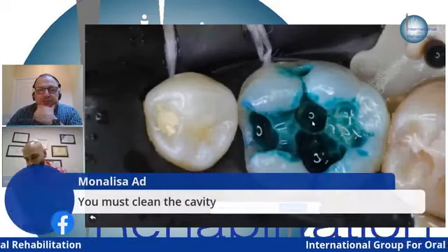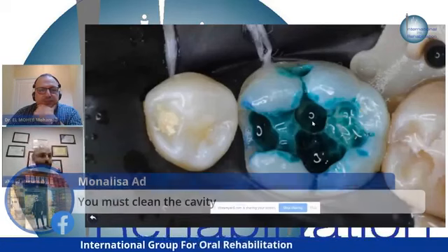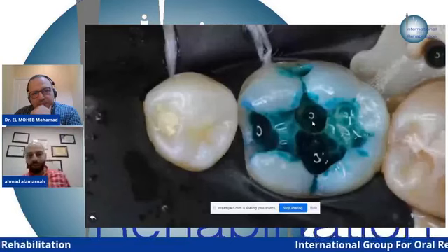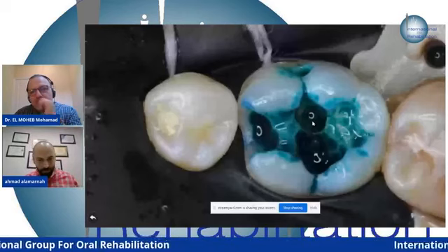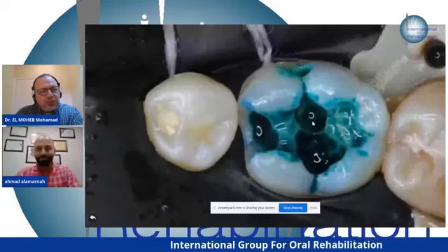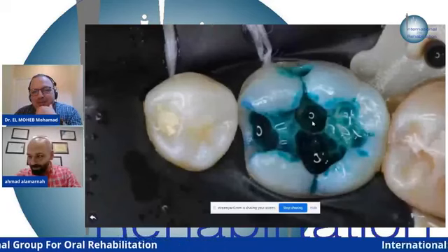Another answer. You must clean the cavity first. Okay, clean it with what? I did clean it with the high speed and low speed. I finished everything. I finished my design. But with what are you going to clean it more? Any answer?